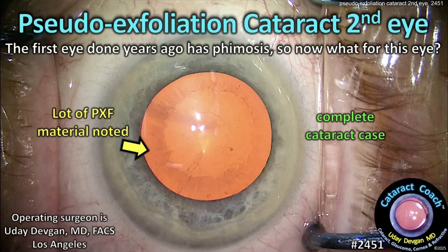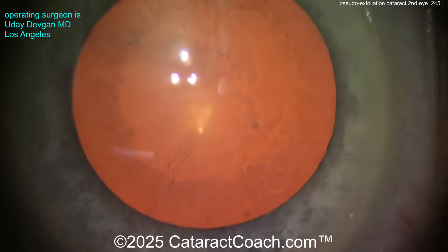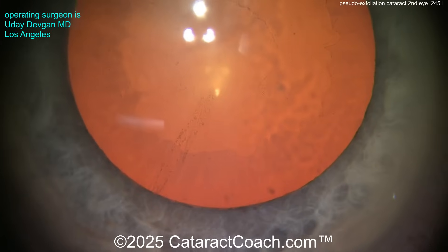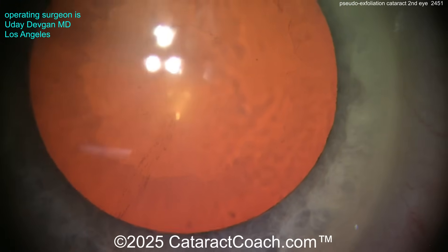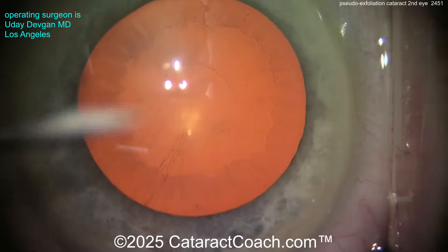cataractcoach.com. Pseudoexfoliation cataract of the second eye. The first eye was done years ago and it has phimosis in the capsule. So now what do you want to do for the second eye? Zooming in here, look at that. There's the capsule and you can see all the pseudoexfoliation material on it. The patient has gotten a lot of doses of 10% phenylephrine and other dilating agents to get this amount of dilation, and it looks pretty good. So we're going to do cataract surgery here — so what should you do?